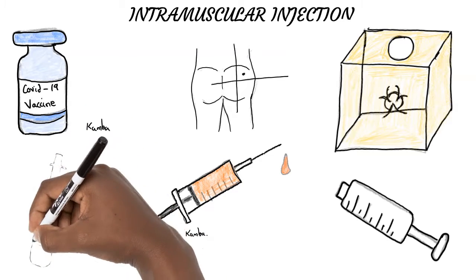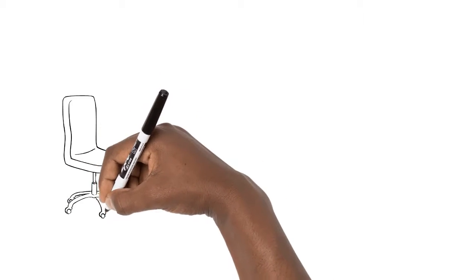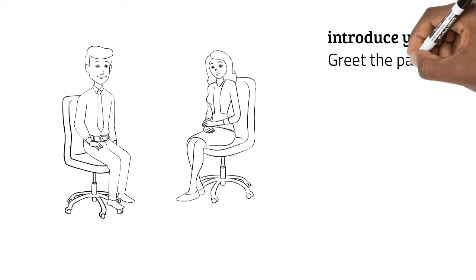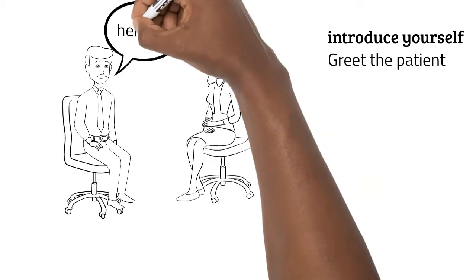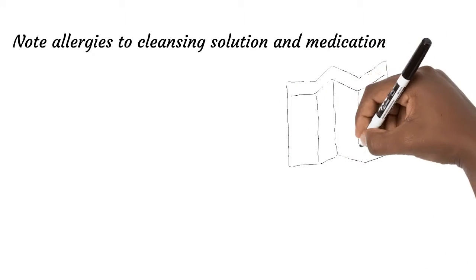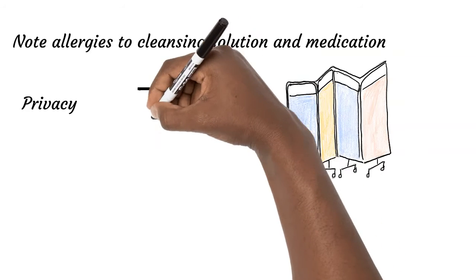To begin with, greet the patient, introduce yourself, verify the patient name, medication order, and file number, and explain the procedure. Always remember to greet the patient because this is marks for you in this exam. Student will obtain consent and will note allergies to cleansing solution and to medication. Ensure privacy and request for a chaperone.